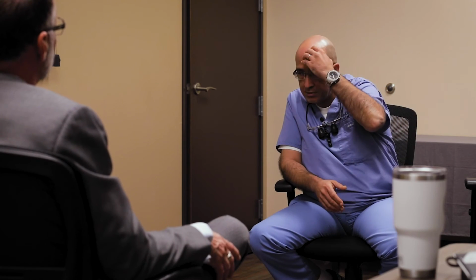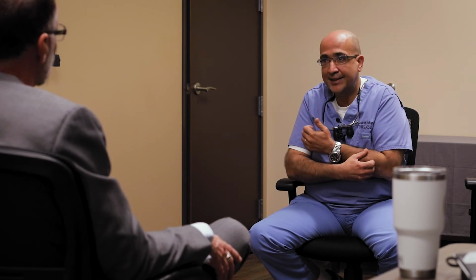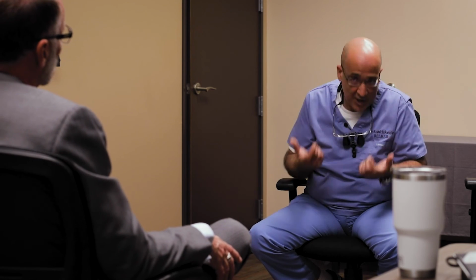It is, yeah. And in that process, when you've done a lot of these, how many of those end up going home in a denture? And I think this is good, it's real, it's not salesy. By the way, sometimes the upper is a denture, we do upper and lower, right? Sometimes the upper is just a denture and the lower is fixed. The lower jaw was in a better condition bone-wise than the upper, so the patient can go home the second day with an upper denture and a lower fixed bridge, right?